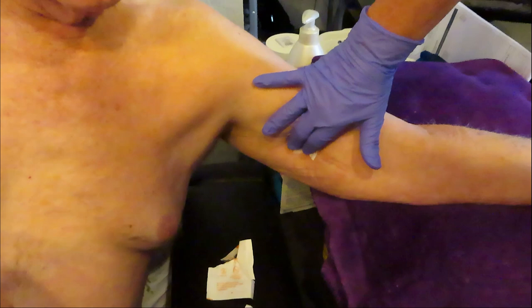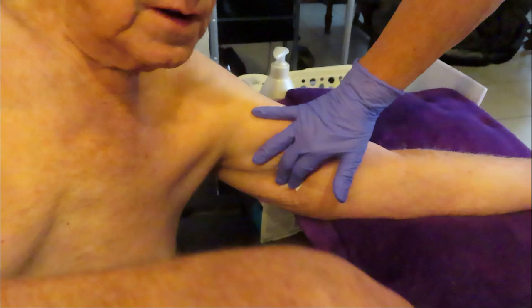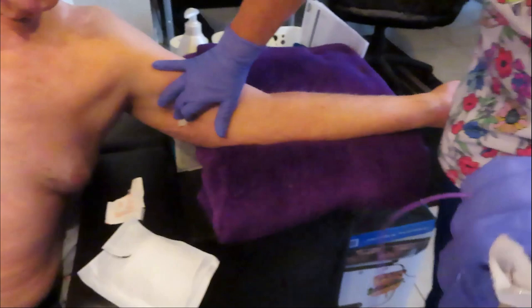You don't want to touch it. Why? Because it's been in. I mean, you can touch it here. I just want to look at the end. Okay, you can dump it in. But that's only one line. So it's actually one line, two inside. So it's just really one line. It's one hose with two through it. See, it has a little... Right. Okay. Weird. And it's not even bleeding. It's not even going to bleed for us. There it is.